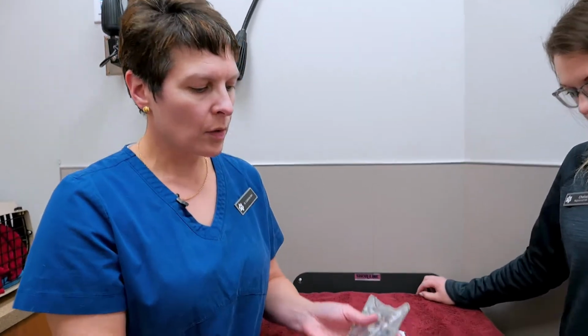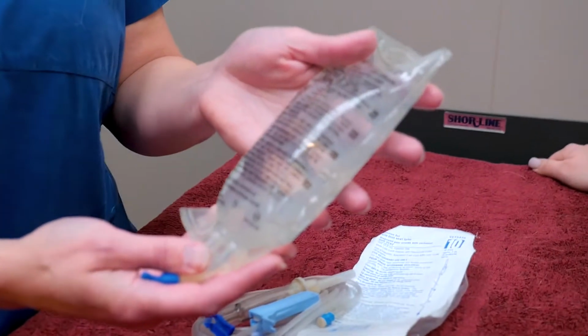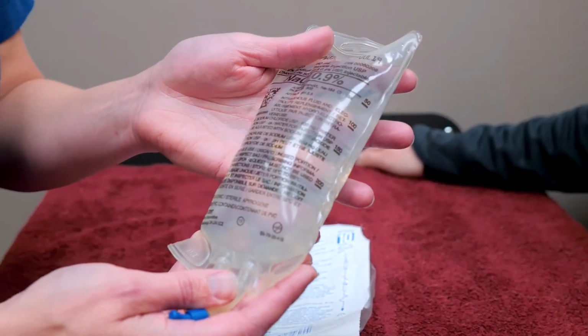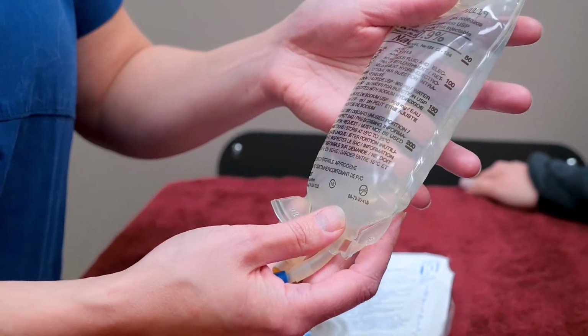So I am going to go through how to set up the bag first, and then we'll show you how to actually administer it to a patient. So this would be a bag of fluids. This one happens to be saline. Usually we would use something with an electrolyte balance that's a little bit more complete for a kidney patient, but we're going to start with using this bag.